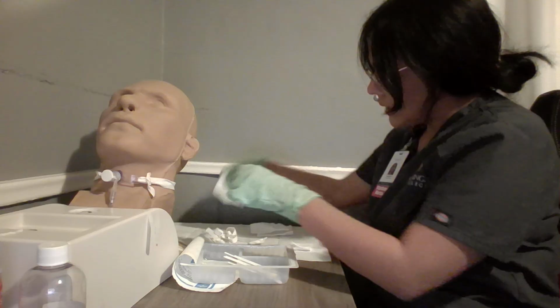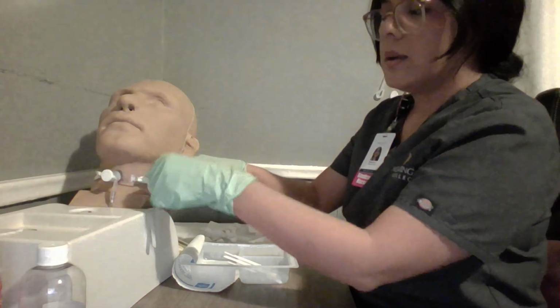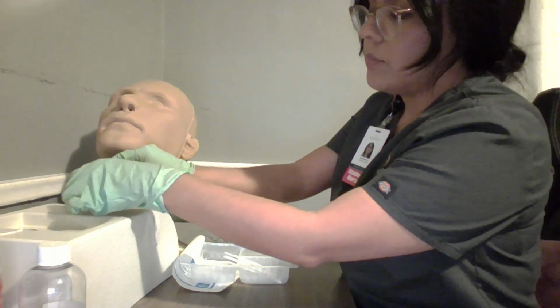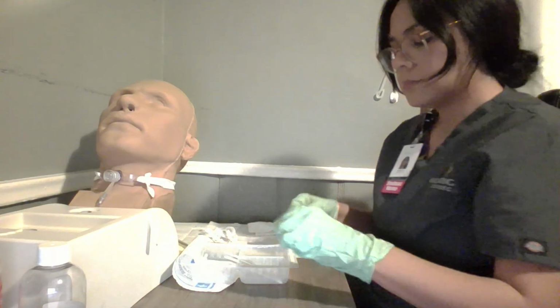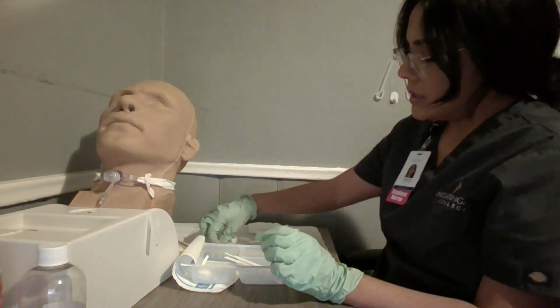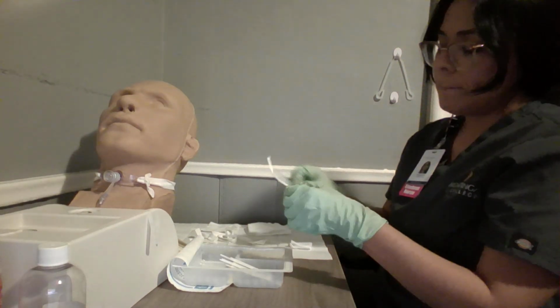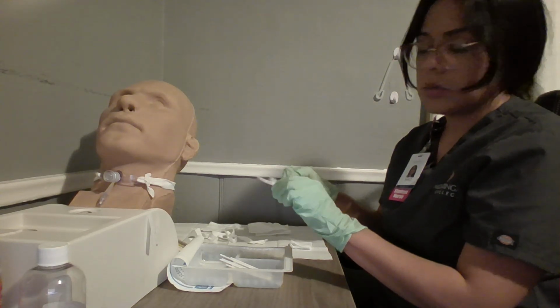I will next remove the inner cannula, and I will gently pull it out here in line with my patient's curvature. I will place the inner cannula in the soaking solution. I will now clean the inner cannula by taking the brush here and using the normal saline to remove the crusty secretions. I will scrub inside and out until there are no more secretions left.